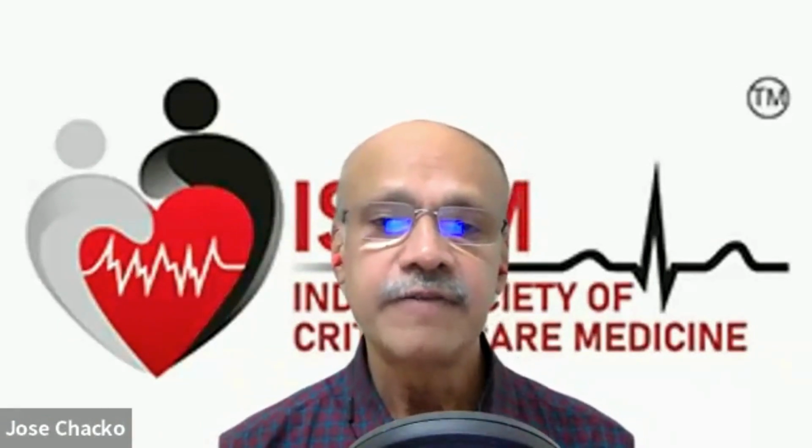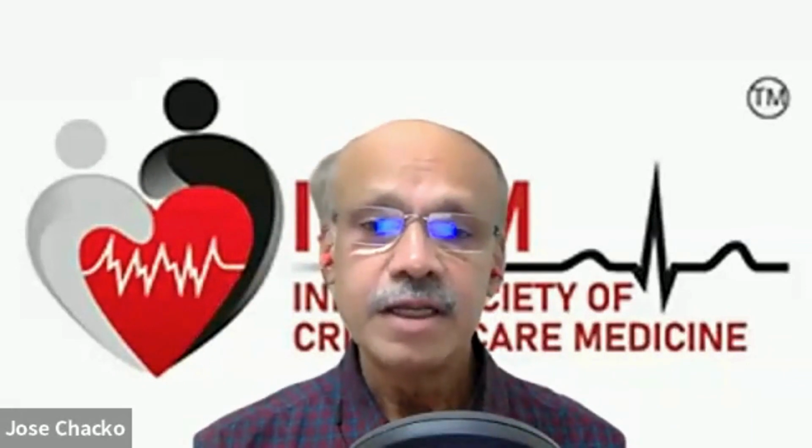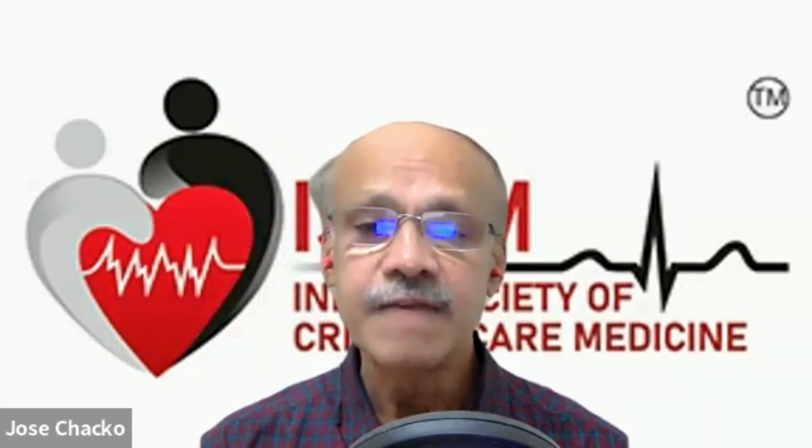We do echocardiography by the bedside, and we are also used to our echocardiography technicians performing echocardiography by the bedside. If you look at the way they do the scans, you will be struck by the kind of meticulous measurements that they perform, including the wall thickness, precise estimation of the diameters of the chambers, precise estimation of the ejection fraction. There are so many things which perhaps the critical care physician may not look at through a microscope, which may not be all that relevant to us.